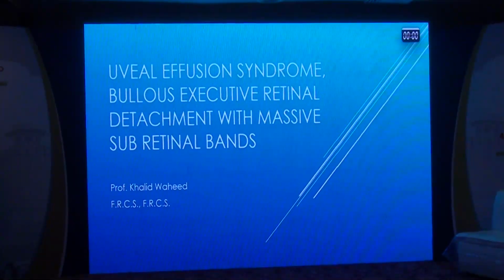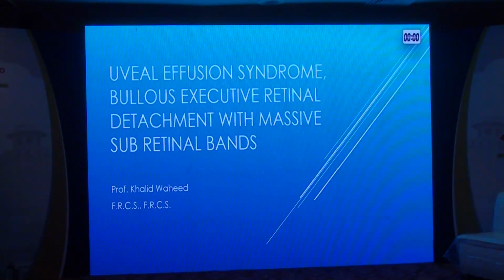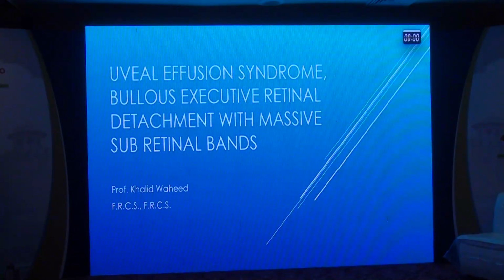So the first thing in my mind was, what is the diagnosis? She did not have any indication. After when she presented, to my horror, I noticed that she had 5 massive islands of subretinal fibrosis, and it was like 5 trampolines sitting on her retina, and each ring of that trampoline was elevated just like a tabletop, and her vision had dropped to hand movement. So I thought that it's a good indication to do a vitrectomy in her case. So let's move on with that.